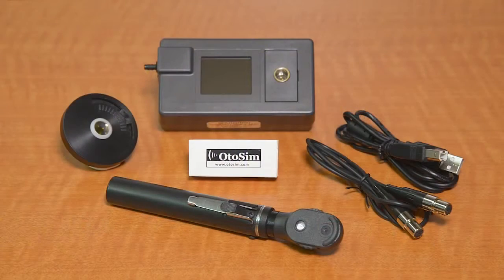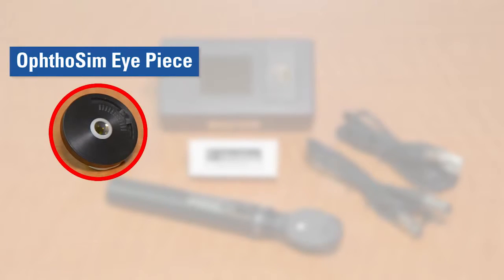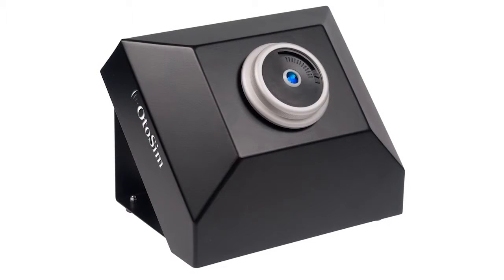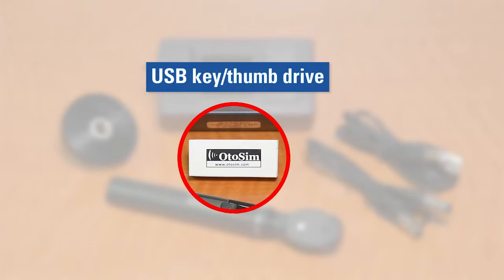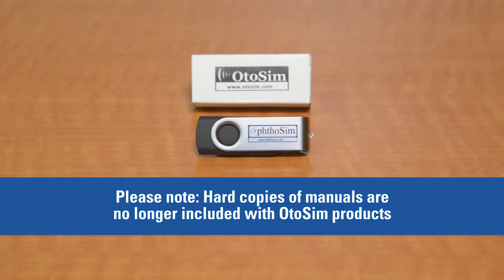Your Authosim Upgrade Kit consists of the following components. 1. Authosim Sensor Box. 2. Authosim Eyepiece — this is the lens that is placed on top of the Odosim Display Unit. 3. USB Key or Thumb Drive — this contains the software installation package for a PC or a Mac computer, as well as an electronic copy of the installation manual. Please note that we no longer provide hard copies of product manuals.